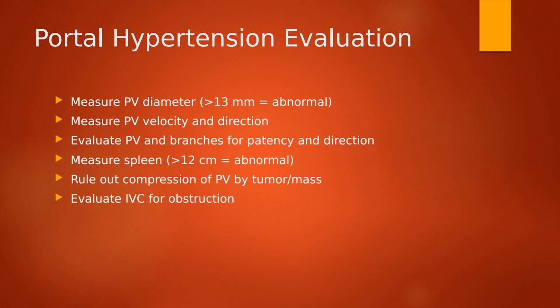And then we want to make sure that we're evaluating the IVC and making sure that there's no obstruction or blockage there. The main concern with having an IVC thrombus or obstruction is obviously going to be the risk of embolism or heart attack. Portal hypertension kind of takes a back seat to IVC obstruction or thrombus.